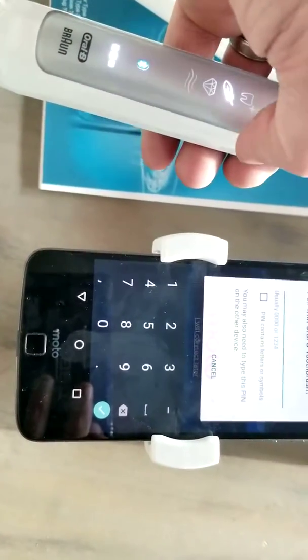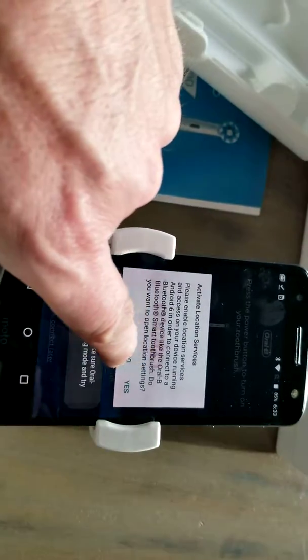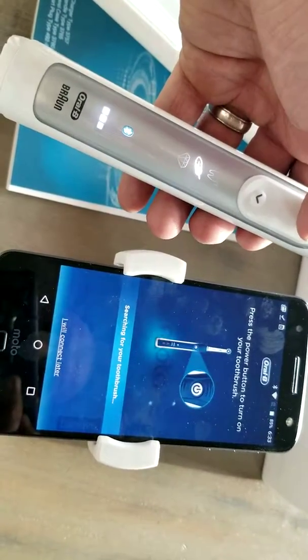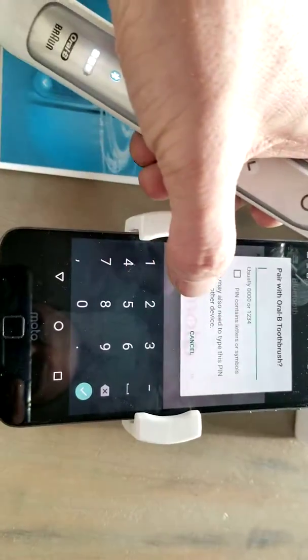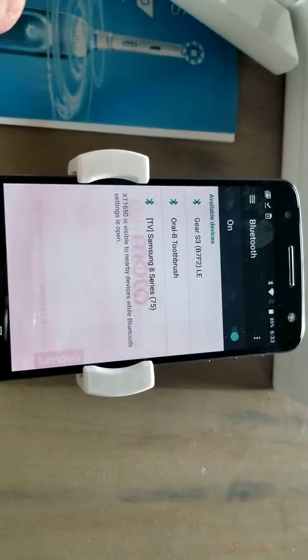Interestingly, I didn't want to bore you to death so I shut it off, but as soon as I turned the power off, it connected. So just put in the code 0000, which is usually what anything is going to be. Put in our 0000, hit okay, and let it connect.